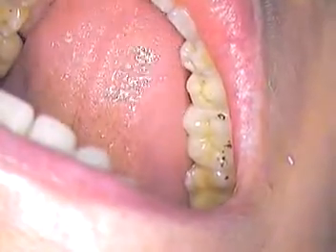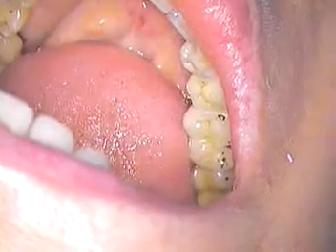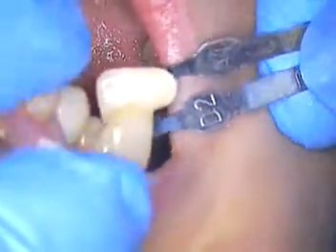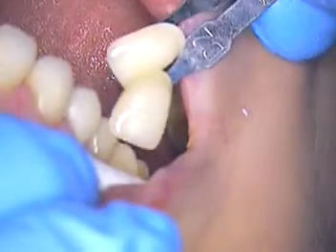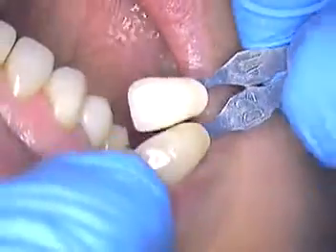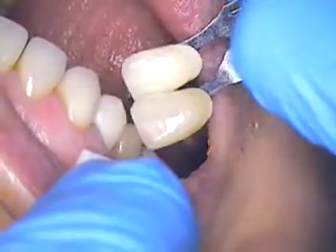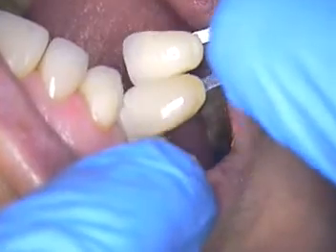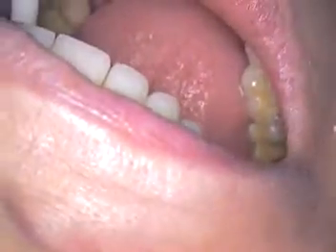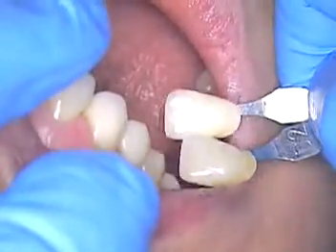So we're just going to take a look at a couple of things. We'll look at color and get ready to take a photograph, just going to decide where we are with color. We've selected an A1.5 D2. Looks like we're going to be pretty close to that — I'm almost looking at a straight D2, but I think we'll match it.